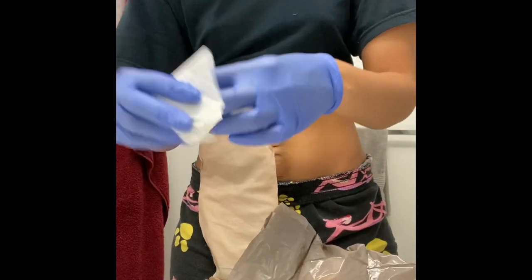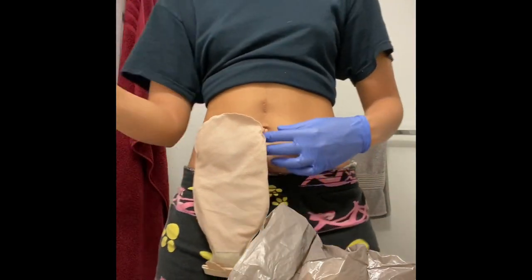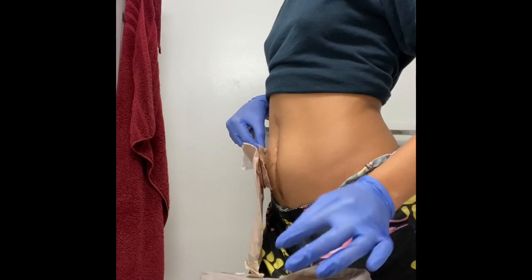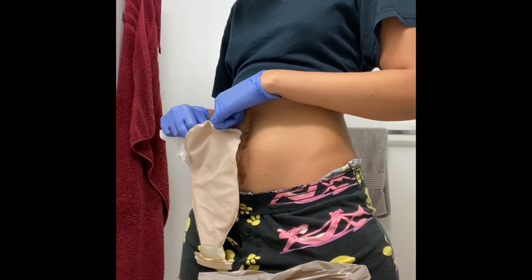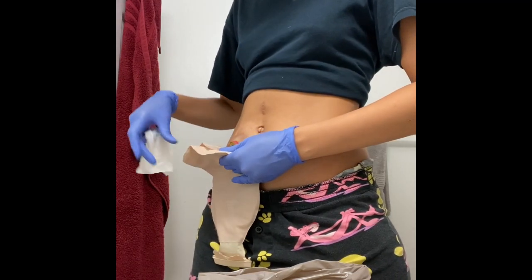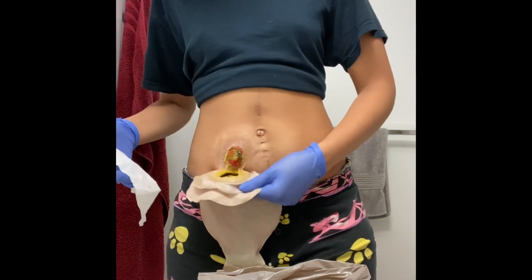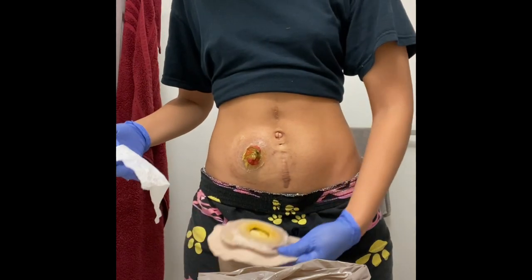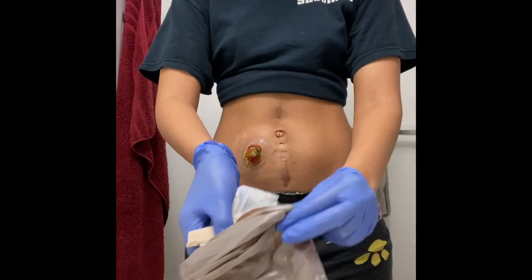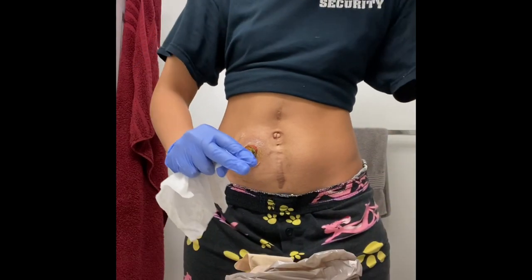I'm so excited — now I'm going to get started. I'm going to get some water on one of my paper towel squares and get it wet with warm water. I'm going to slowly start removing the bag. As you can see, I am carefully taking the bag off. I slowed this section down so you can see how much care I put into removing the bag, being careful not to tear my skin.